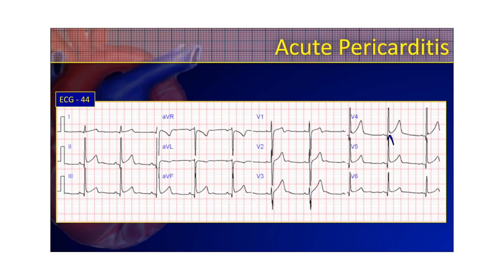On this one, you even have a little bit of J-point notching — notched J-points — like you see with early repolarization, and it is going to look a lot like early repolarization. You may have PR segment depression with your more viral pericarditis. One big indicator is this thing called Spodick's sign, where you get this downward trending of the isoelectric line. It starts at the J-point and goes downward all the way into the PR segment, creating little stair steps. That's called Spodick's sign, and it's indicative of acute pericarditis.